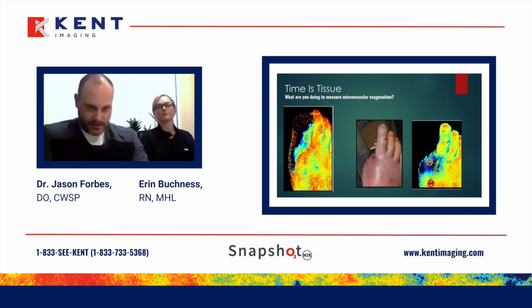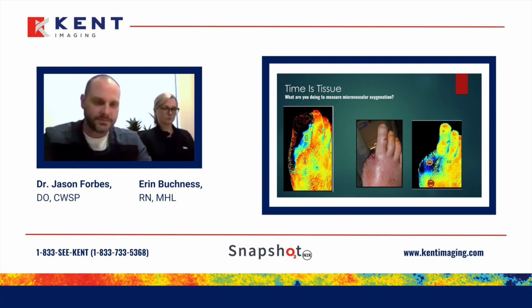So to get to the question, how early can you see significant changes with the camera versus seeing it in your clinic? That is such a nuanced question because it's a little bit different for everybody. I can only give you anecdotal evidence there because part of the limiter is I don't see people more than once a week. If I could see them every single day and catch it, I could say that was the 24-hour difference or the 48-hour difference. So I only have the 1 week to know. My answer is going to be 1 week, because I'm going to see it right after surgery.